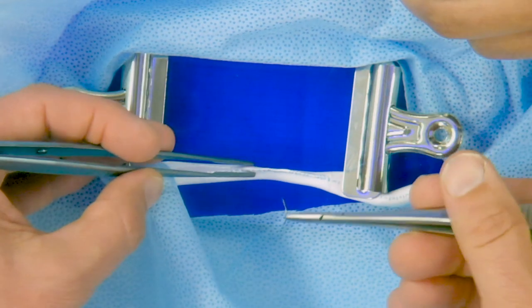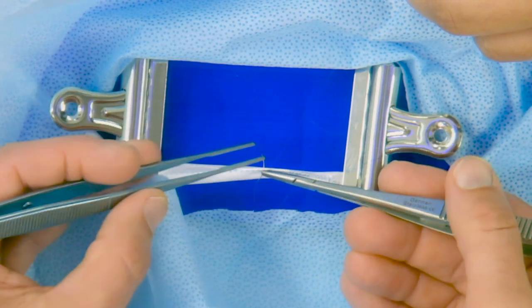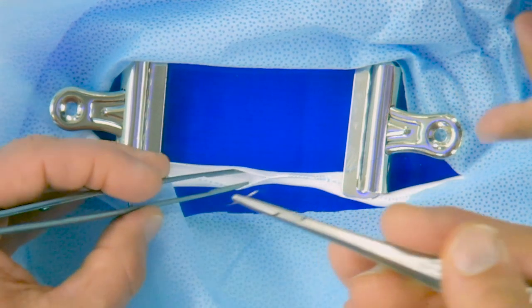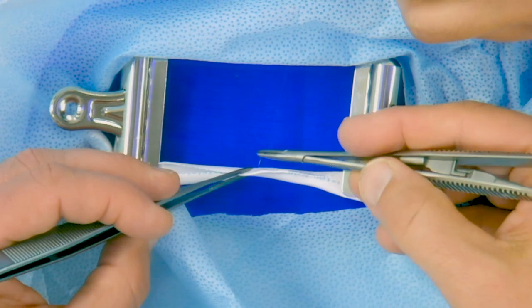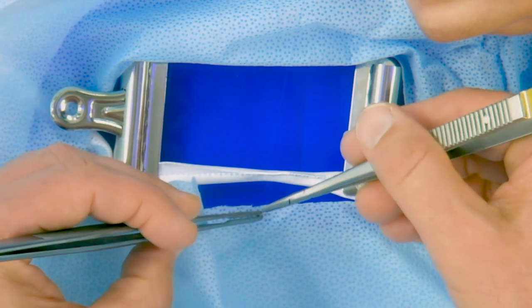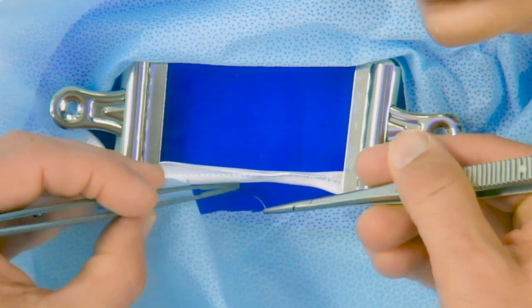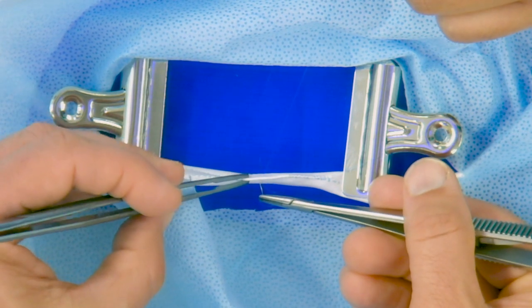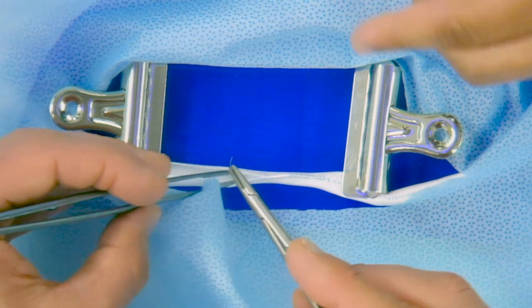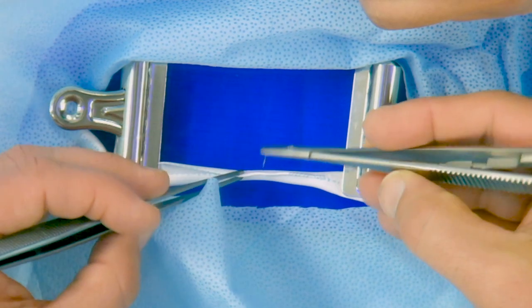During practice, focus to get the maximum benefit. First, focus on needle handling. Proper positioning of the needle within the needle driver, passing it back and forth between needle driver and forceps and back again, positioning for forehand and then backhand. Next, work on proper bites, sizing and spacing, and lastly, speed. It's important that you do these in this sequence.